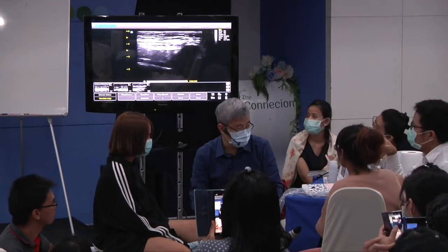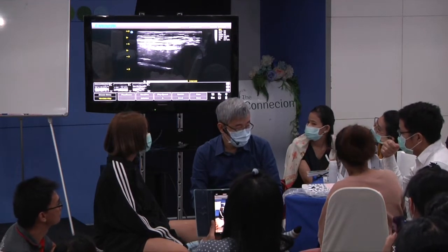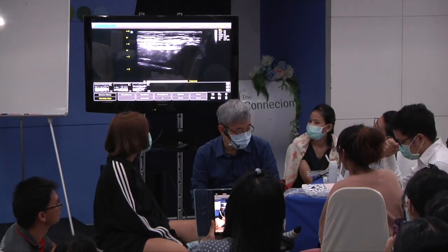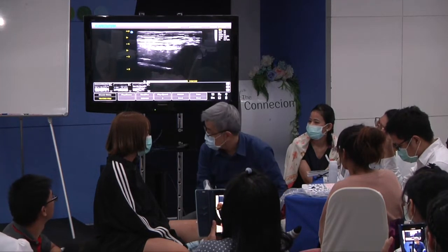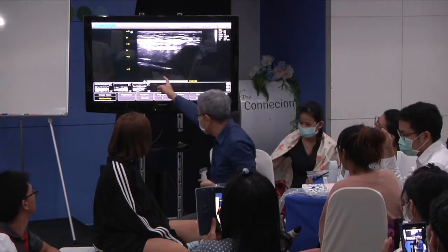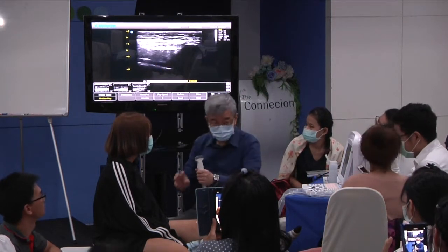Okay, in this view, I include the prefemoral fat and the pre-patellar fat.